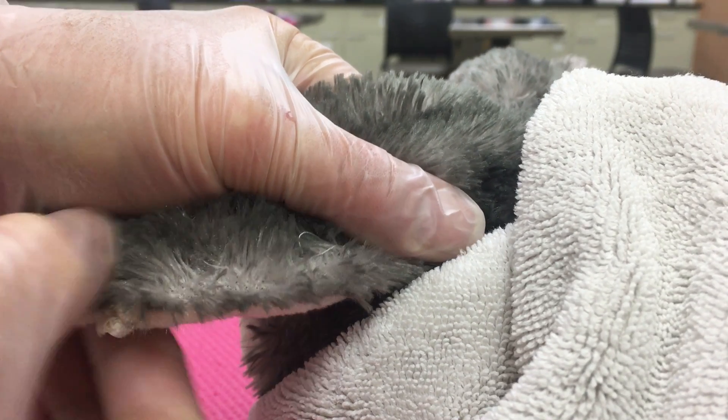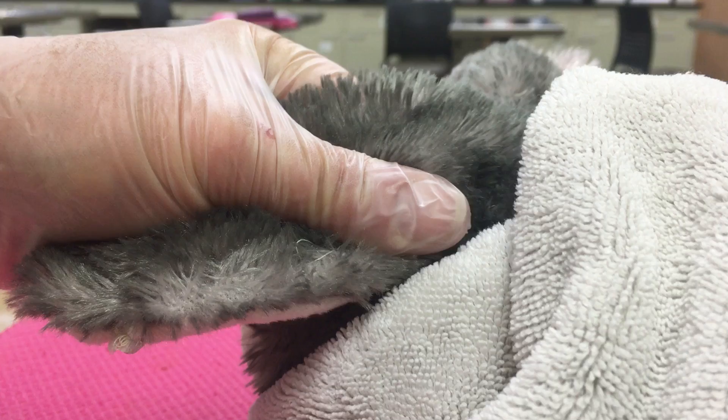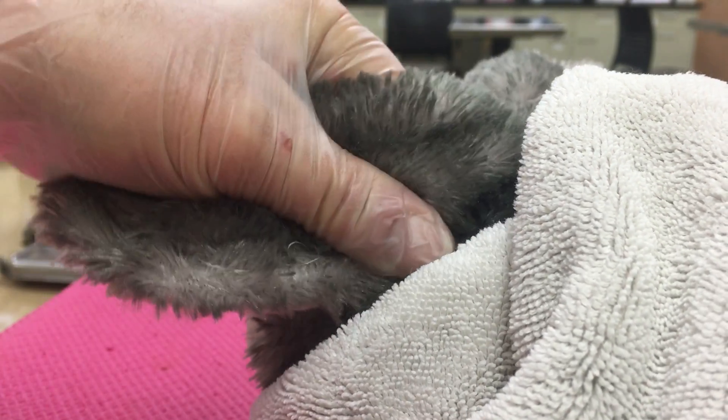I'm going to kind of flatten that ear out and hold the ear well here so the rabbit can't pull it out of my hand.